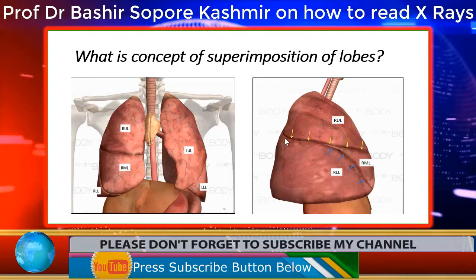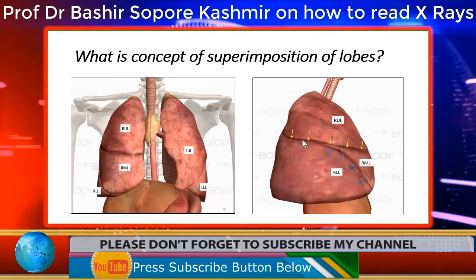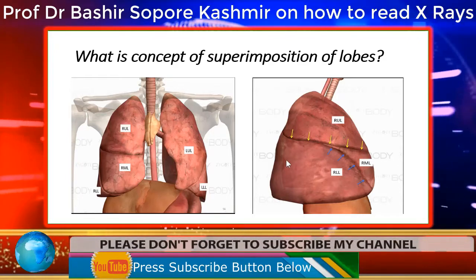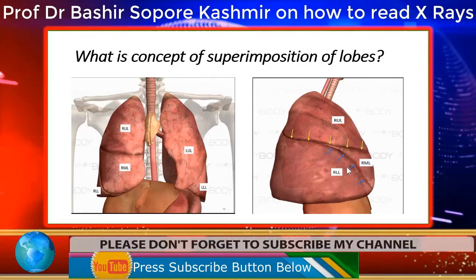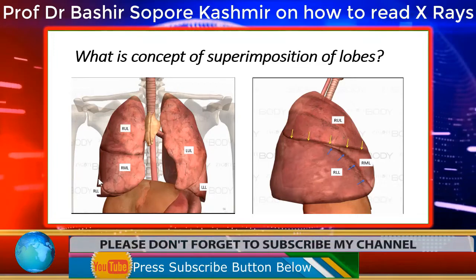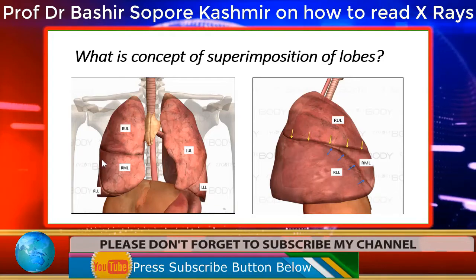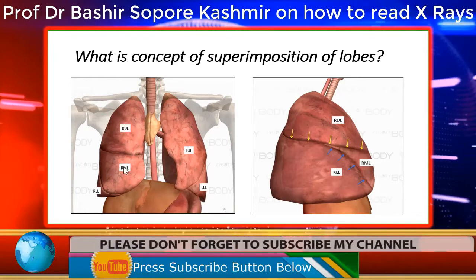So you can see that depending upon the size of the opacity due to various lesions, if the size is more, then we won't be able to see the right middle lobe, because this will overlap over the dark portion of the right middle lobe. So this is because of superimposition. So what I mean to say is that this is the lower lobe here. On the back, see how much the lower lobe extends up as well as lower, touching the diaphragm. So if there is opacity in the lower lobe, then this middle lobe will also appear radio-opaque.